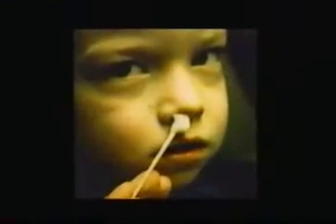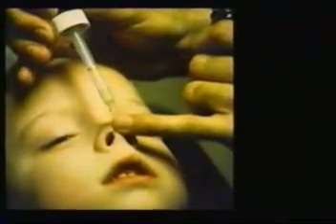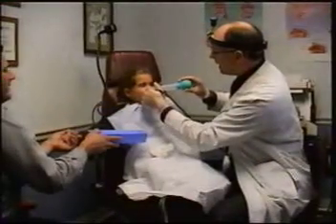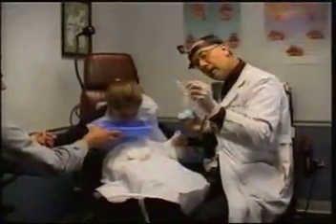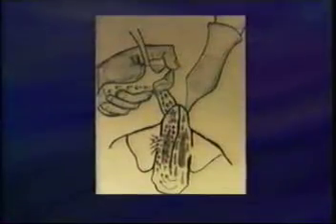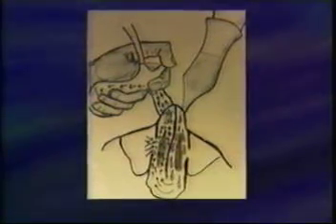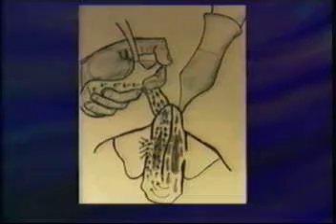The nasal vestibules are cleaned with cotton-tip swabs and peroxide, and the passages are prepared with vasoconstrictor agents. Saline is then introduced to one side of the nose with a bulb syringe and aspirated from the opposite by the aspiration irrigation apparatus. As the patient repeatedly says the letter K throughout the procedure to close the velopharynx, the water dribbles down the afferent side of the nasopharynx, and the vacuum from the apparatus pulls the saline more rapidly along the efferent side, thereby creating a Venturi effect as it passes by the ostium.